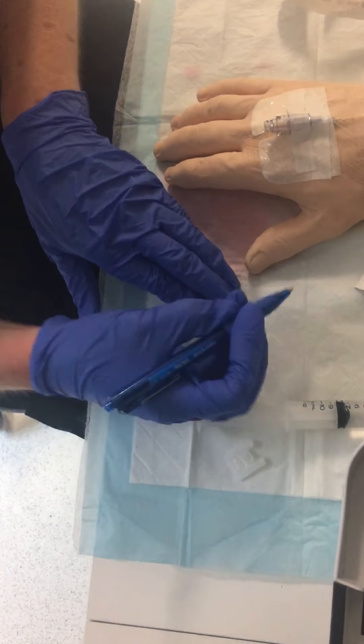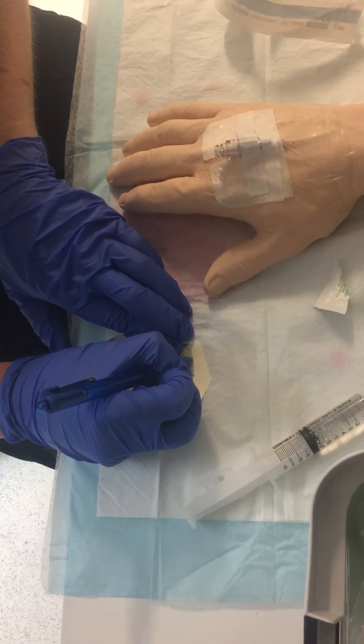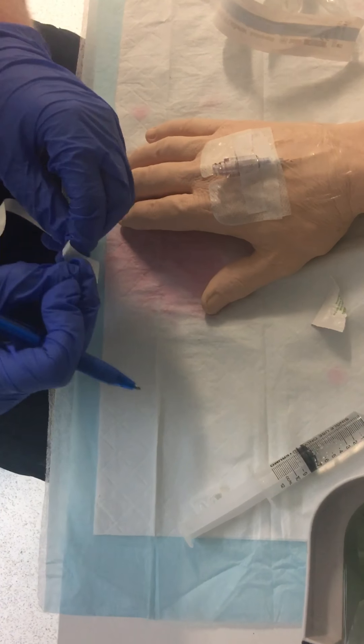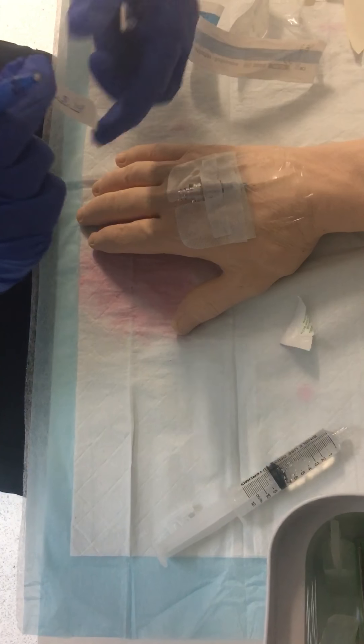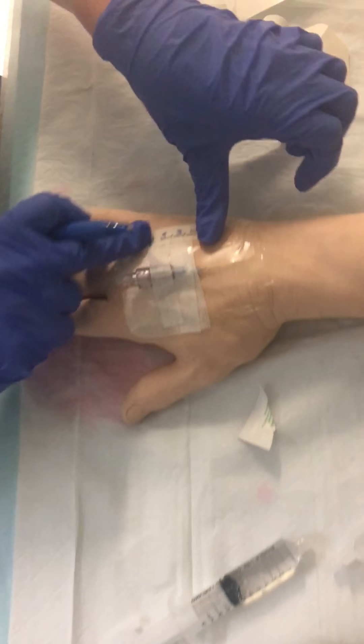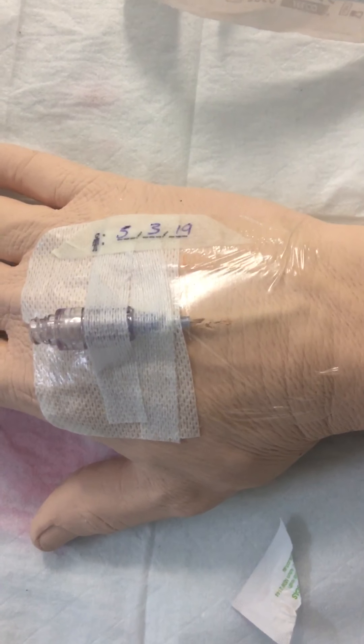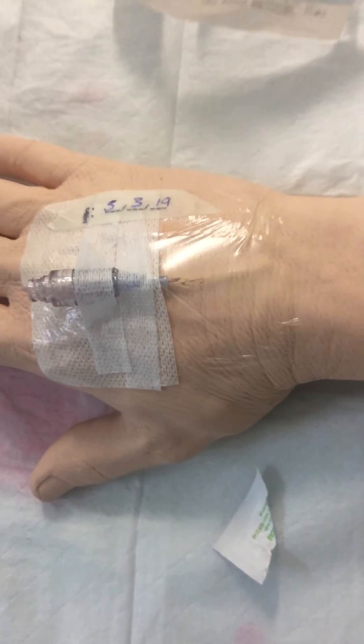Last but not least, you can date it. You want to place this tab on the side to make sure that you still have a good view of the vein in case there's any pain, swelling, or redness. And that's about it — thank you.